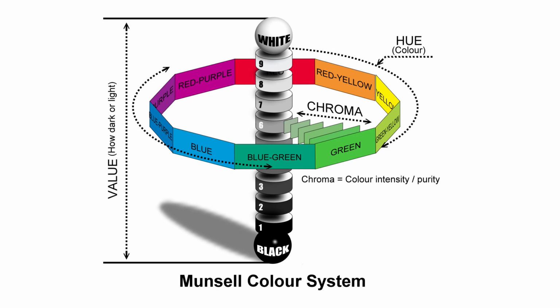Roll tape. What are shades made up of, and why are they so important? It should be as simple as matching a tab to a tooth and writing it on the lab slip, but it really isn't. We aren't simply trying to communicate a single hue, or color as we say more often. We're also attempting to distinguish the shade's chroma. Now this is the level of saturation in that hue, as well as the shade's value. This is the level of the white or dark overall.